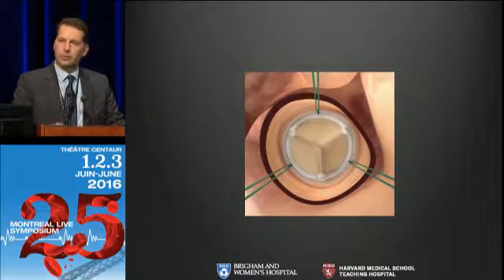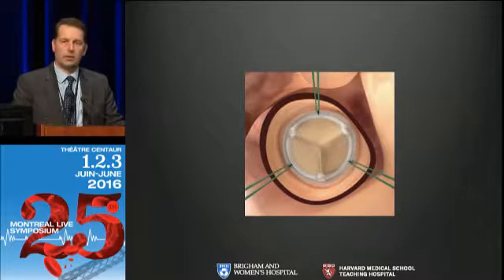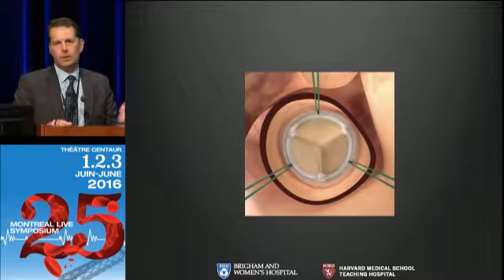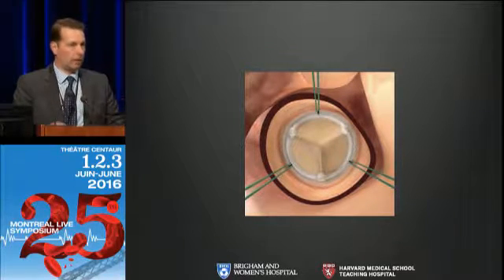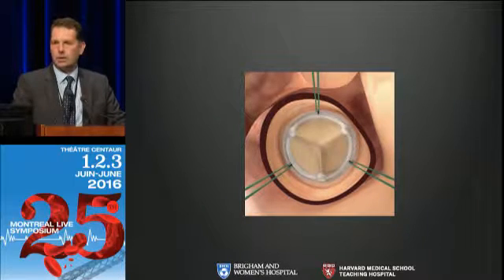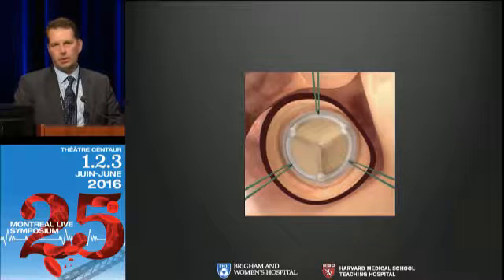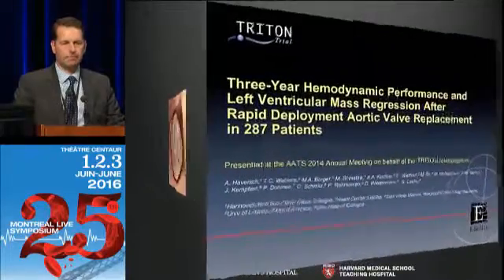It's guided in with 3 sutures, and those 3 sutures are tied in, so they're single sutures. So it's not truly a sutureless valve, but it's 3 sutures as opposed to typically what would be 10 to 12 sutures with a standard valve that are all double loaded and then tied. So there's quite a bit less tying to this valve. And the tying part of a valve is usually about a 10, maybe a 15-minute exercise. So if you can decrease some of that down to 1 or 2 minutes, you're saving some time.